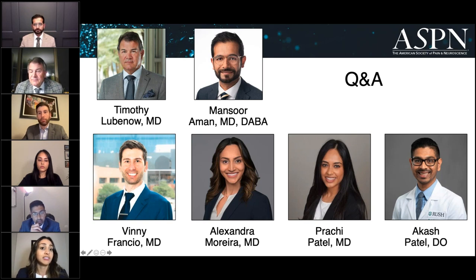My understanding is that it's not typically appropriate for L5-S1. Yes, the reason is that you need to have a caudal spinous process, and for the most part, the spinous process at S1 is really just a remnant of bone. Very occasionally, you might have a spinous process at S1 capable of receiving the caudal aspect of the Vertiflex implant, but for the most part, this is something that's meant to be done from L1 through L5, but not through to the S1 level.